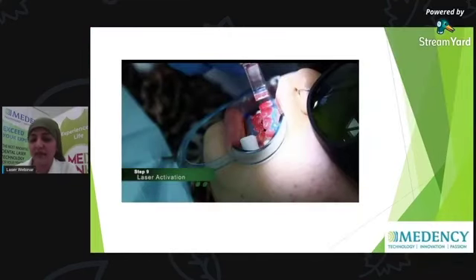You are going to activate the laser. Of course, it depends on the patient. If you find the patient has a good enamel and is indicated for the procedure, every procedure has a limit of power. Whether you are going to lower your power or raise your power is upon the case. So you have to know what is the most suitable power for your patient, without hurting them or making them feel pain.